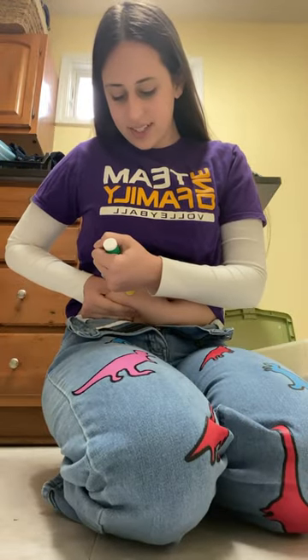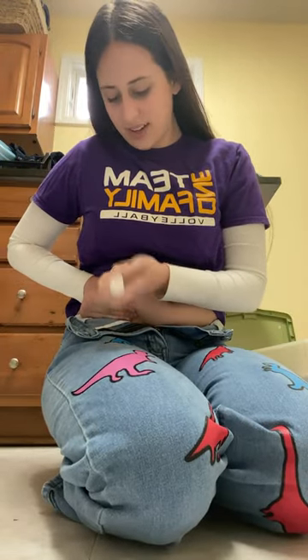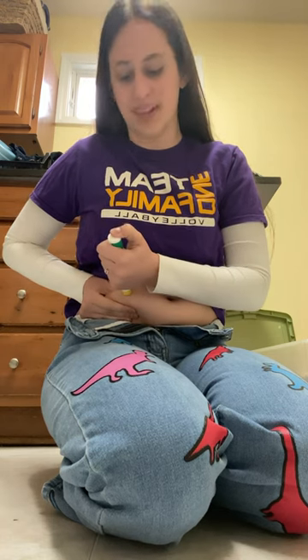So let's inject it. I'm gonna inject it in my stomach. So I took the lid off and — oh, I'm so scared. Why did I say — oh, I was so scared. It's the first time doing it at home.